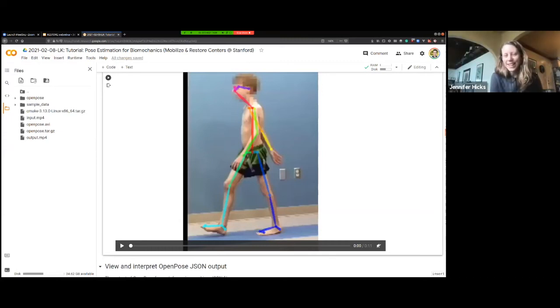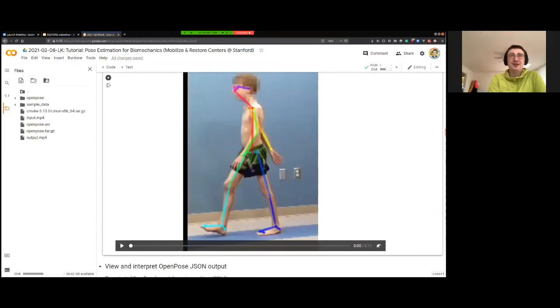Okay, thanks, Lukasz. Now a question from Kat Steele. Hi, Kat. She says, very cool. Thanks, Lukasz. Are you experimenting with integrating this with OpenSim? So the main challenge or opportunity here is that we have only 2D videos. There are many 3D positions that can correspond to those 2D projections.